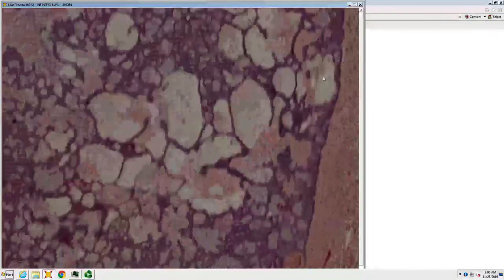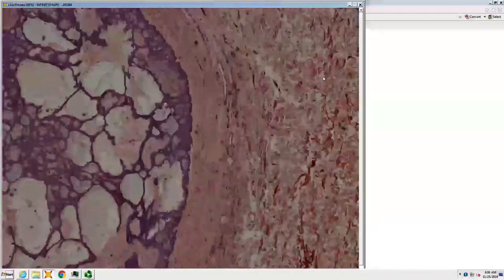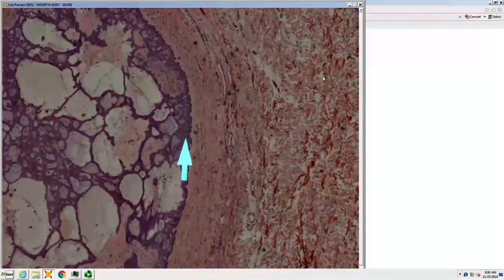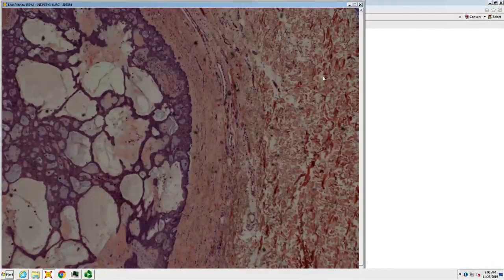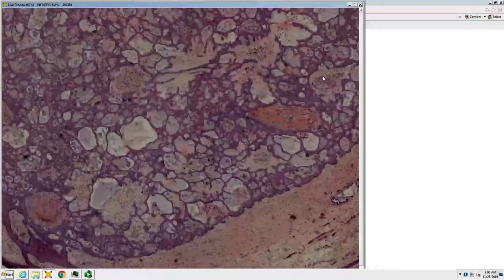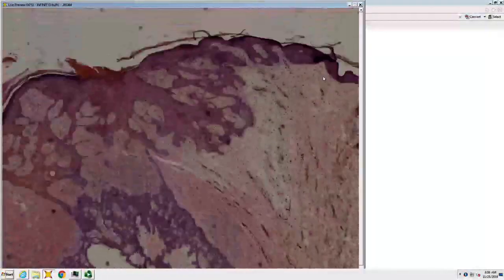Acrospiroma. So this palisades, which acrospiroma would never. Pink strands, blue buds. Yeah, Pinkus tumor. Very good. And Pinkus tumor will always have ducts in it as well, which is why you were thinking acrospiroma.